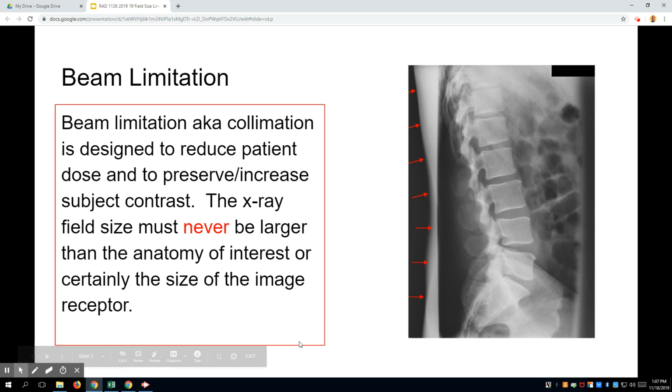And this becomes a little bit more difficult with flat panel detectors too, right? Because usually the rule is you grab the appropriate size image receptor, like cassette, for the object. So if it's a hand, you get a 10 by 12. But when you're in a DR room, you always have a 14 by 14 or maybe even larger flat panel, and you're really forced to collimate, right? I mean, you still need to collimate with a cassette, right? You could have it open completely and then have a small 8 by 10 cassette. But it's not as obvious sometimes when the flat panel detector is underneath and you can't really see the borders of collimation the way you can on a cassette compared to the way you see on a flat panel detector.